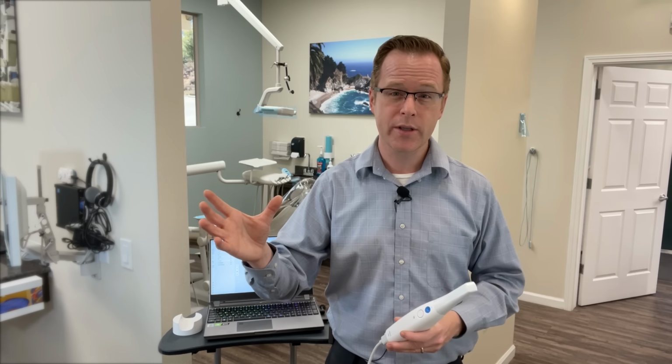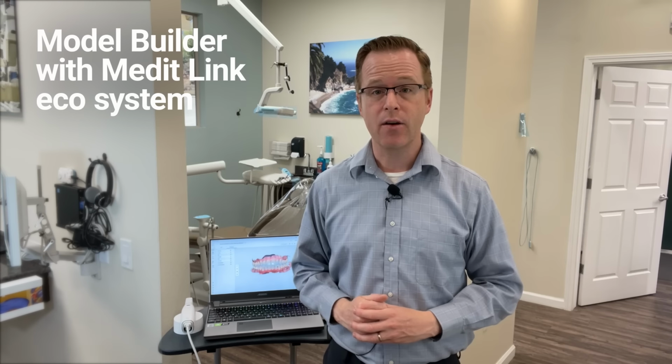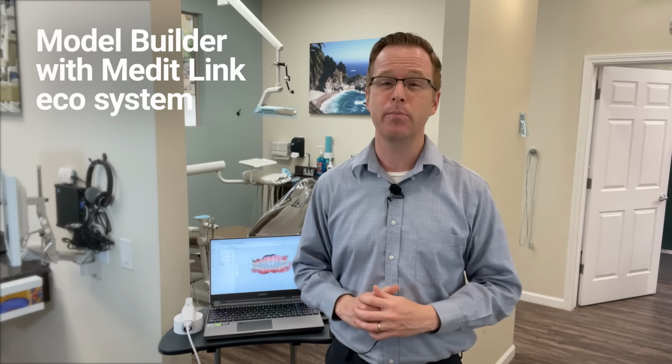By being able to utilize a built-in model builder software in our Medit Link software, it allows us to be able to transfer those intraoral scans directly onto our 3D printer in just a matter of a few clicks. So when we're thinking about efficiency in our clinical practices, we want to be able to take that intraoral scan from our patient and directly and easily transfer that to our 3D printer. Once we've gone ahead and scanned our patient, it's a matter of a few clicks of being able to go ahead and access the model builder directly built into our Medit Link software.